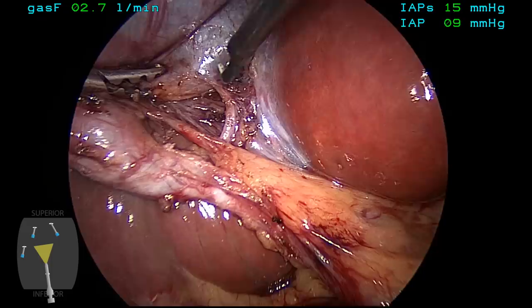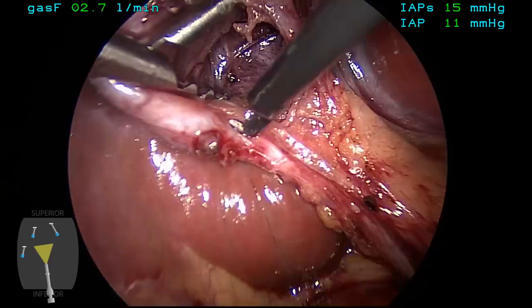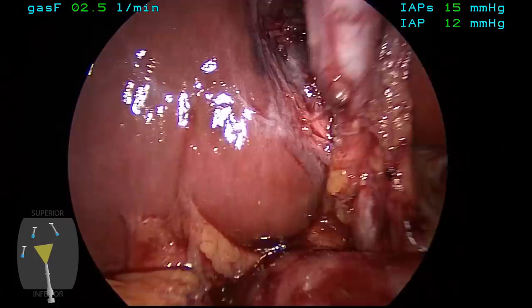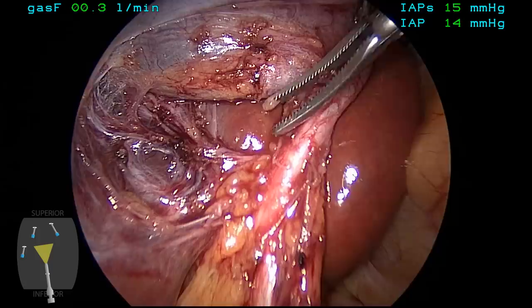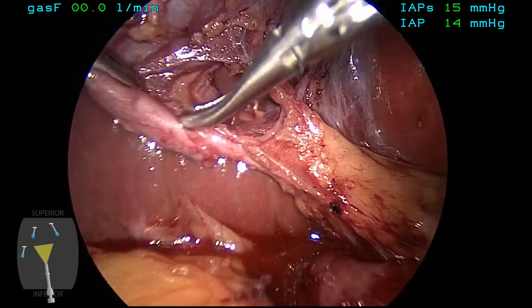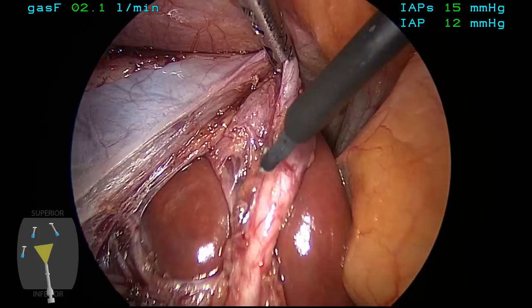The gallbladder is then moved back to the anterior view and we divide some of these remaining peritoneal attachments to get the lower part of the gallbladder off the liver bed to expose the lower third of the cystic plate. There are some remaining connective tissue attachments and lymphatics in between the cystic duct and cystic artery, and oftentimes there is a short cystic duct artery branch that comes from the artery over to the cystic duct that has to be divided. One should liberally move the gallbladder back and forth during this part of the operation and can use a combination of blunt dissection and the L-hook monopolar to clean this tissue out.